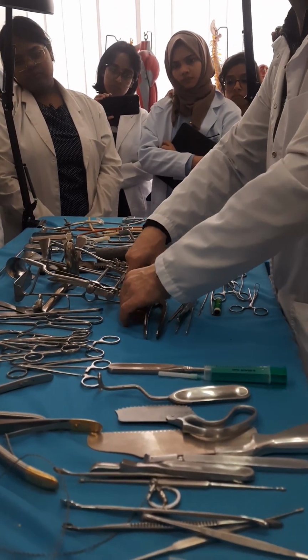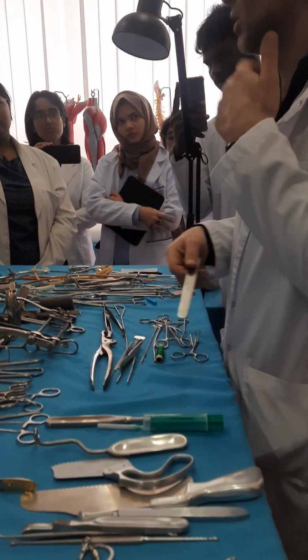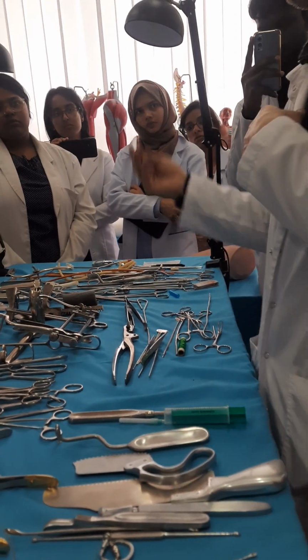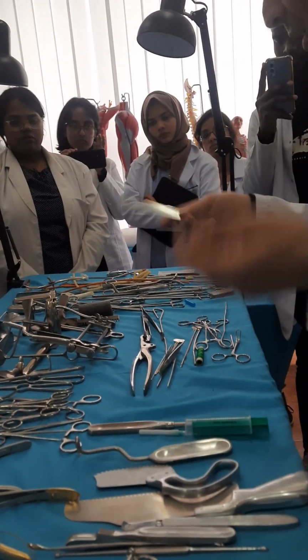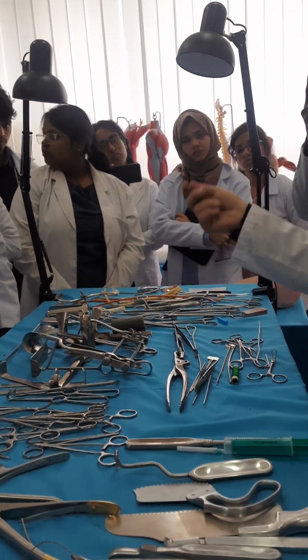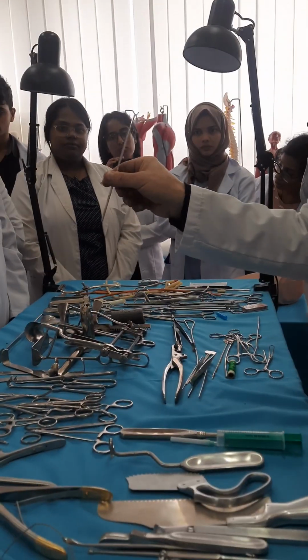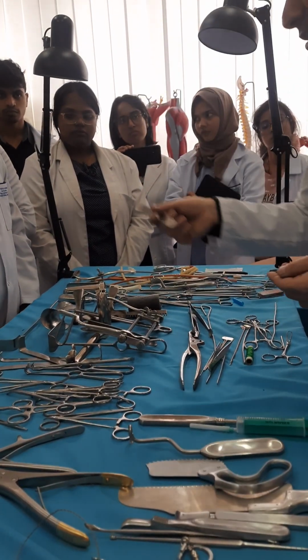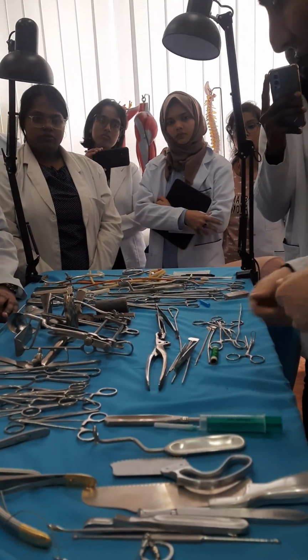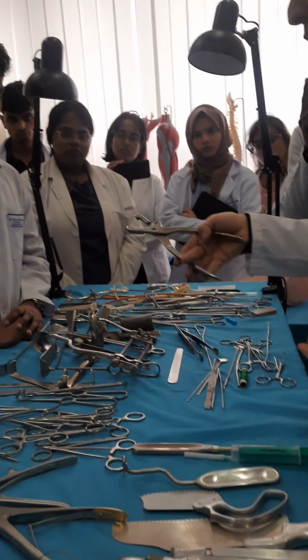Spatula, I think everybody sees and everybody has experience, especially during stomatological or ENT practices, to push the tongue, to see the pharynx, to see the tonsils. Usually it is the retraction of the structures, pushing of the structures. It can be metallical, such kind of instrument. We can sterilize it and use it long. It can be wood, it can be plastic. It is single-use instruments.